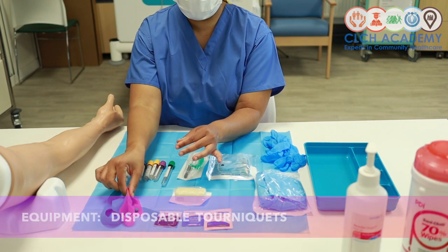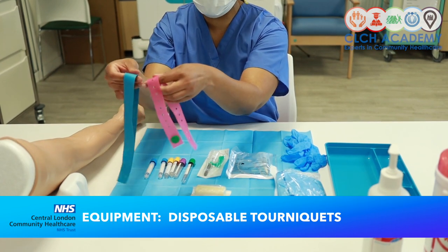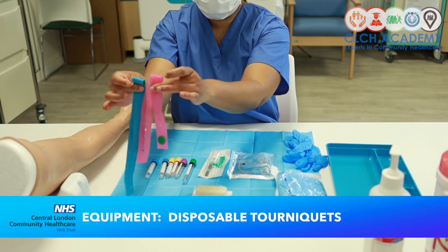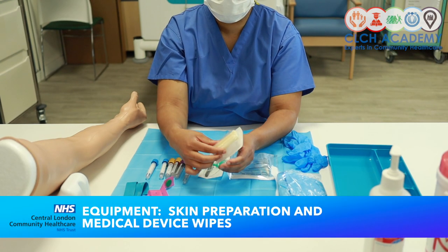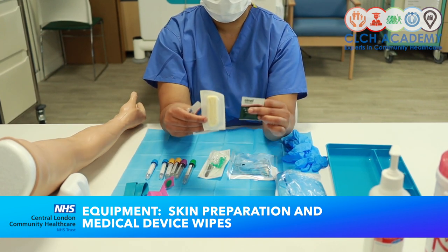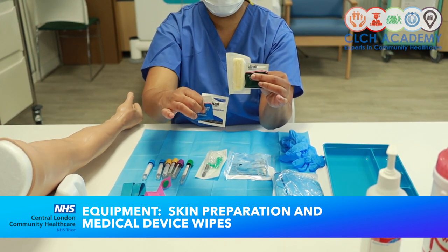And then we've got our disposable tourniquets. I've got a combination of two tourniquets because these are common tourniquets used within CLCH. And I will show you how to use both these tourniquets. Next, we've got an assortment of skin preparation as well as medical device equipment. You may have seen these at some point within your clinical or treatment room.